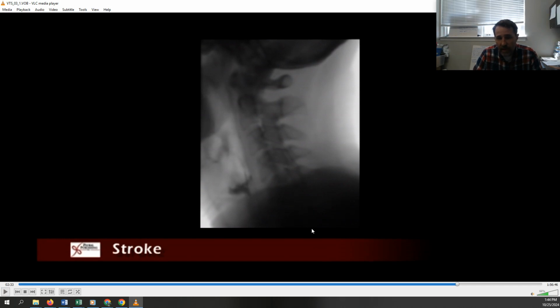Yeah, I take that back. So when we go back, I'll try to go back and watch. You're going to see that the anterior pharyngeal wall, which is the base of the tongue, is going to contact the posterior pharyngeal wall.